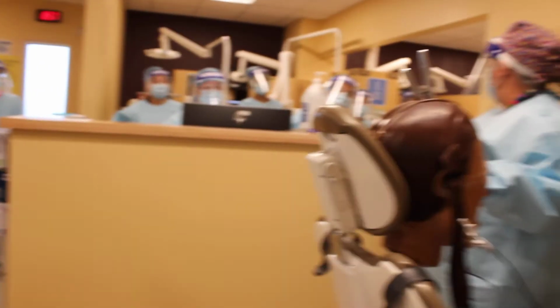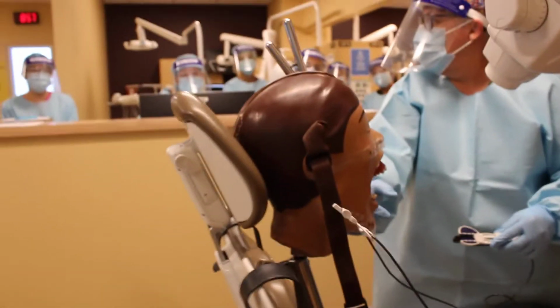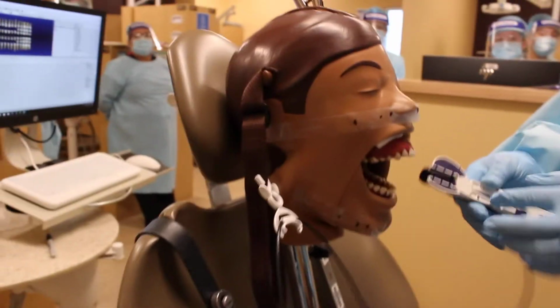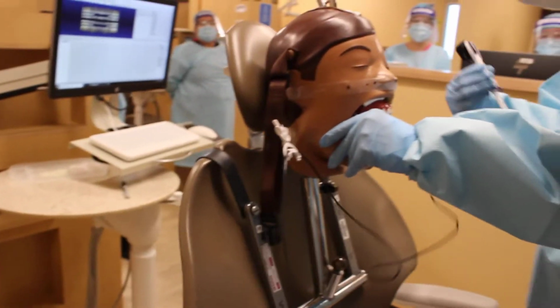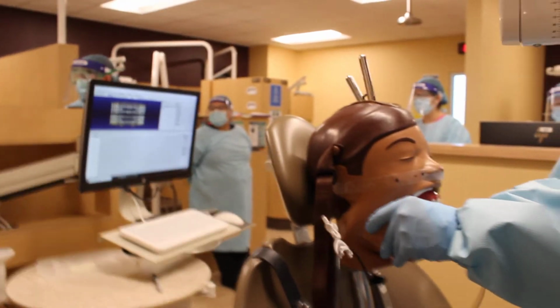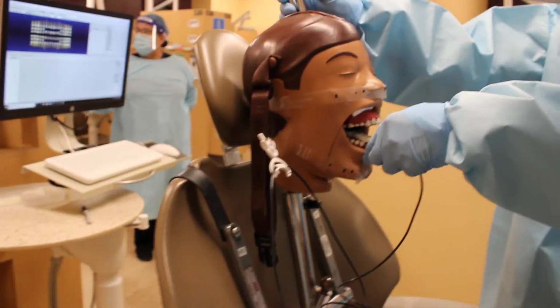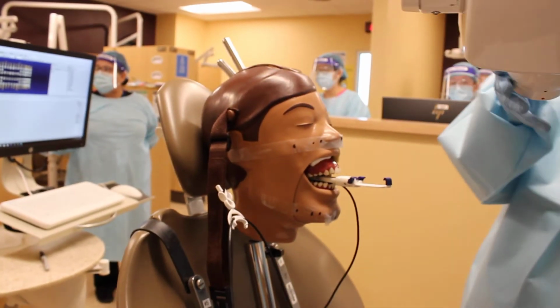So you guys can see the dots. So outer canthus, so this is going to be your central ray. If you guys can show the angulation. Yeah, I'll take it over here. Mandibular molar. Negative 10.